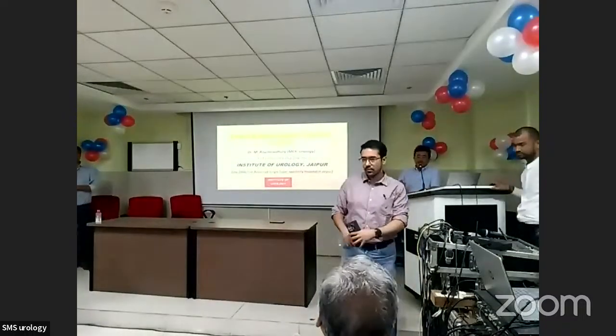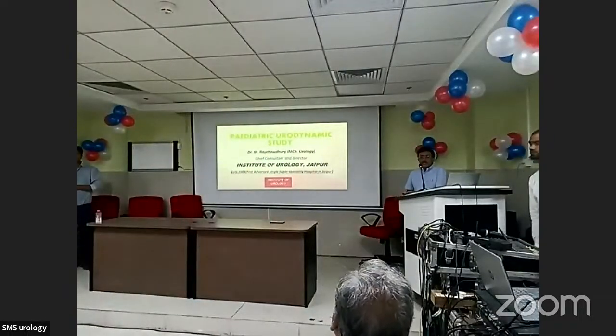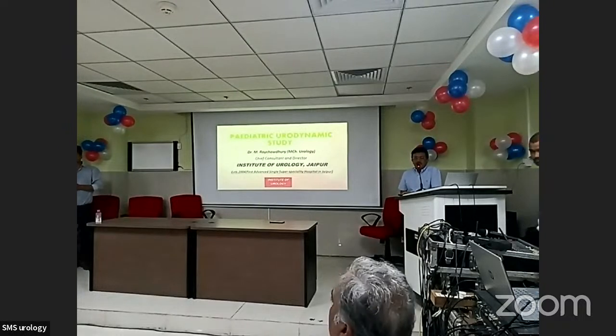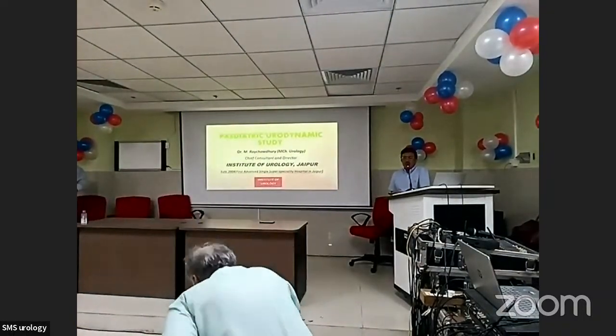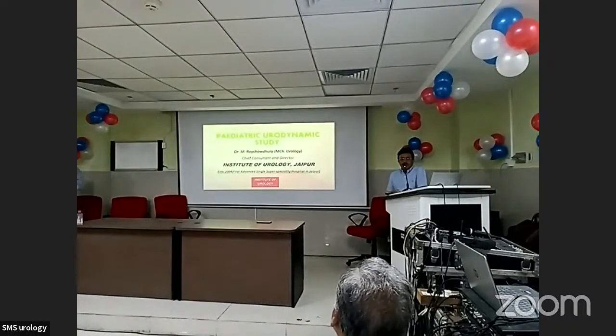Good afternoon, everyone. I'll be speaking on urodynamics. Technically speaking, pediatric urodynamics is almost the same as that in adults, but there are certain differences. And there are many specialized applications of urodynamics in children, unlike in adults. Pediatric urodynamics is not easy to do because a small child is uncooperative, doesn't understand, and doesn't obey commands. Parents are apprehensive and confused, and it really tests your patience.